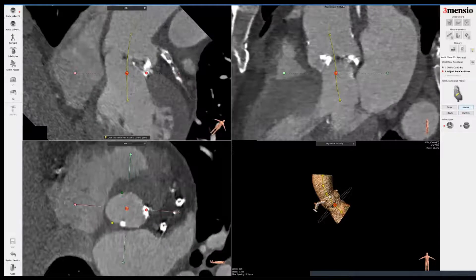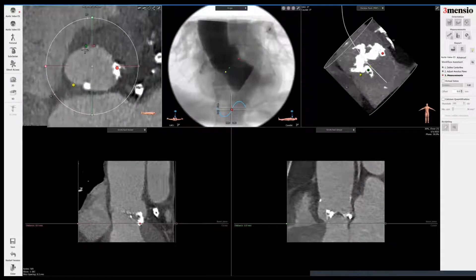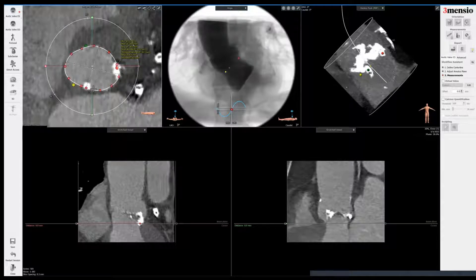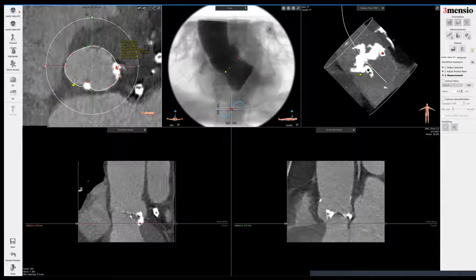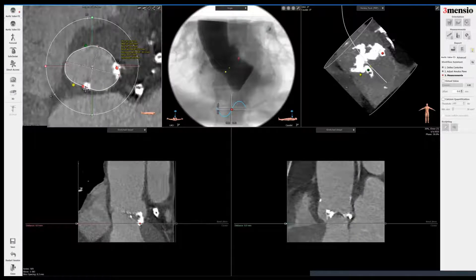I'm going to go to the center line to confirm that everything is center line, then confirm. You can see this is the annulus of this patient. Now I'm going to do the lasso tool and just quickly go around the annulus. You can see this is a chunk of annular calcium here. I don't go in here to trace inside, because what will happen — I'll show you — if I do that, I'm going to have a much larger, longer perimeter than estimated. My area is going to be smaller than actual, because the valve is going to occupy the entire space including the calcium, and this calcium is going to get compressed or risk being pushed out. That's how you get root injury. So I don't do that — I like to just cut across the calcium.